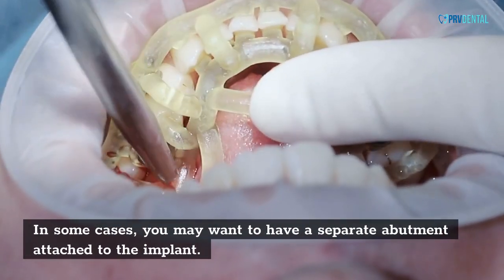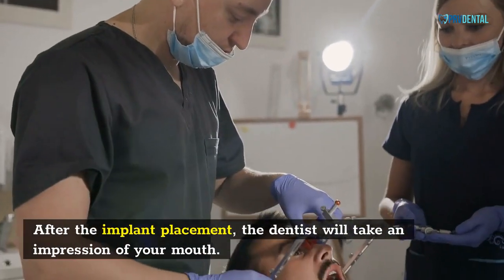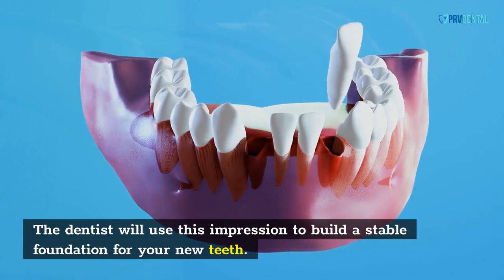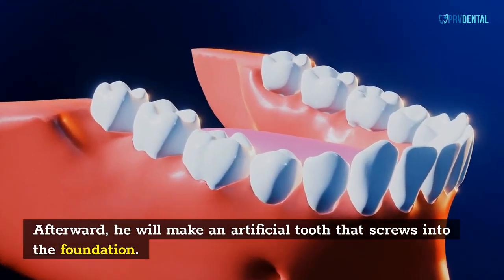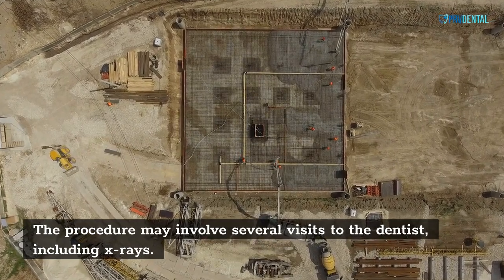In some cases, you may want to have a separate abutment attached to the implant. After the implant placement, the dentist will take an impression of your mouth and use it to build a stable foundation for your new teeth. Afterward, he will make an artificial tooth that screws into the foundation. The procedure may involve several visits to the dentist, including x-rays.